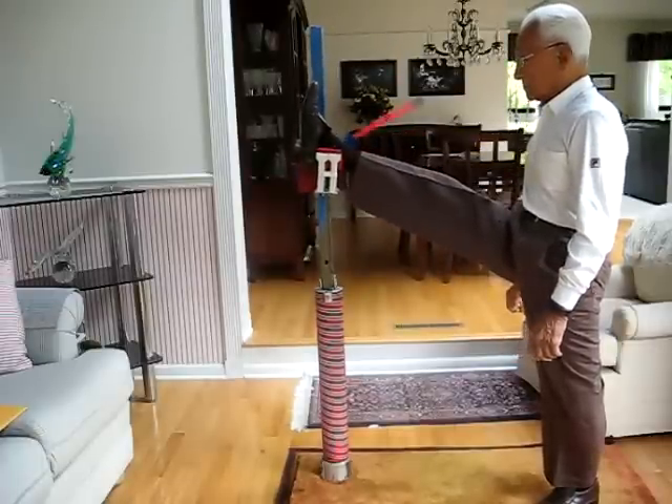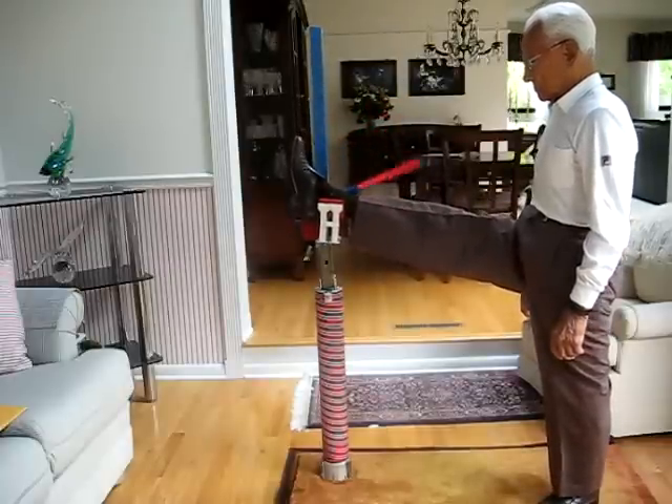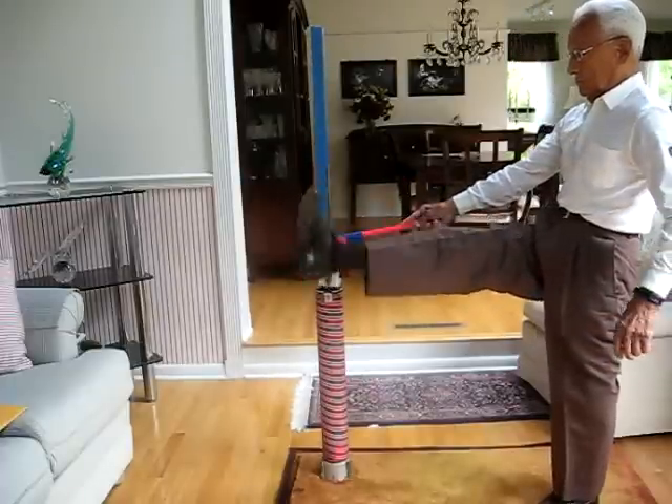I'm going to release it. Down he goes. And then he repeats it with the other leg.